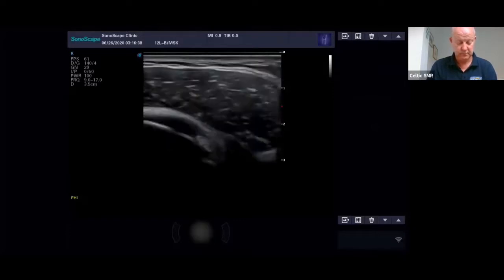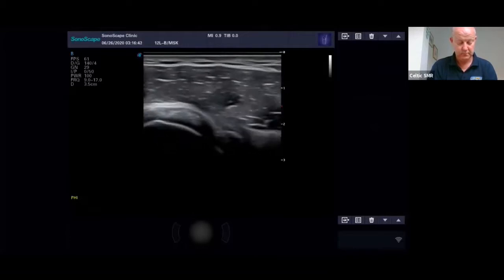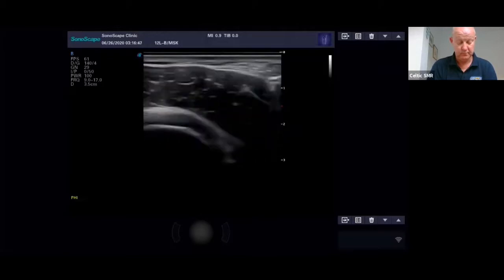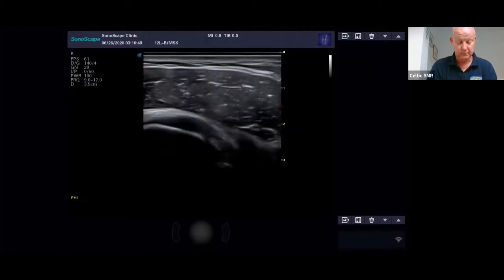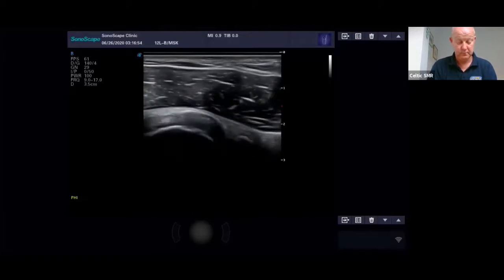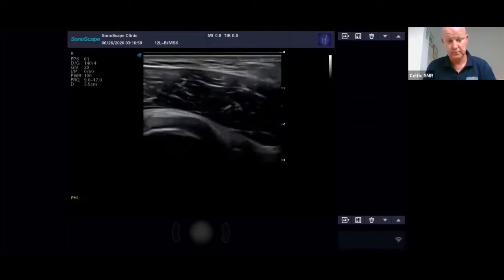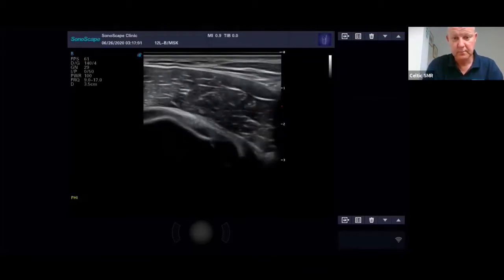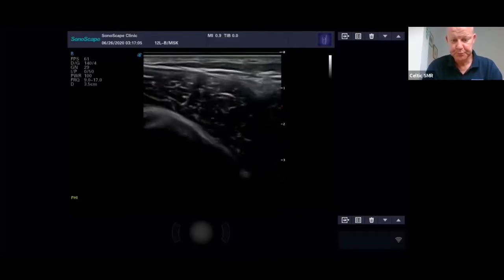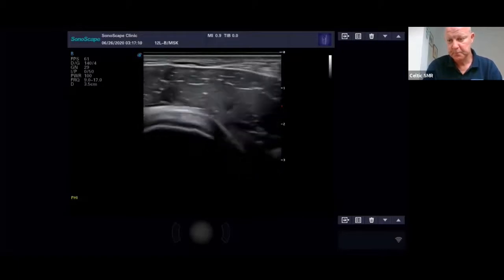So if I unfreeze that, when I find that position, I can bring this into the center, and then I can scan all the way through. I'm constantly adjusting my position to keep that supraspinatus at its brightest. So you can see I'm constantly angling the probe to make that as bright as I can, right down to the insertion here. Okay, and then back.